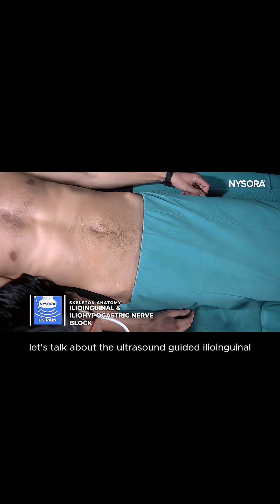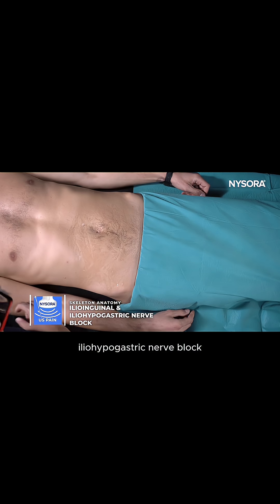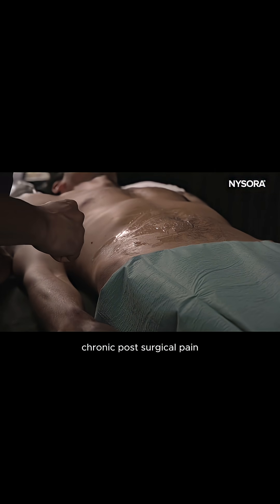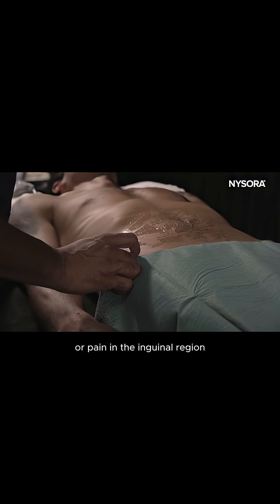Let's talk about the Ultrasound Guided Ilioinguinal Iliohypogastric Nerve Block. This nerve block is useful for post herniorrhaphy, chronic post-surgical pain, or pain in the inguinal region secondary to inguinal neuralgia.